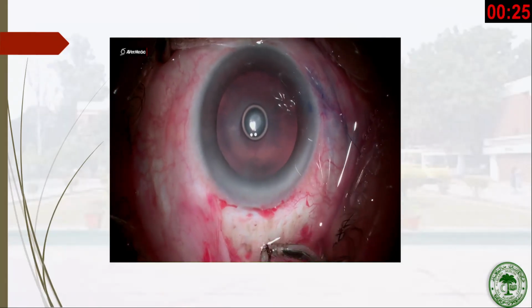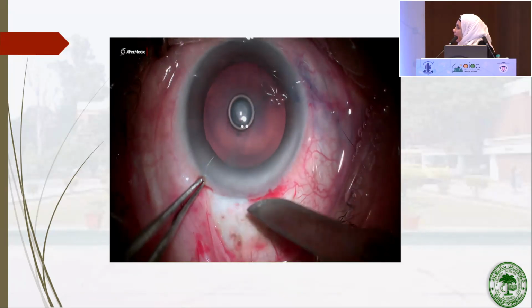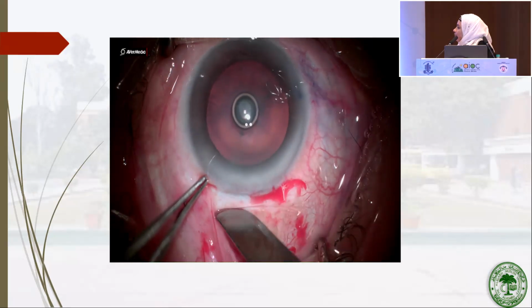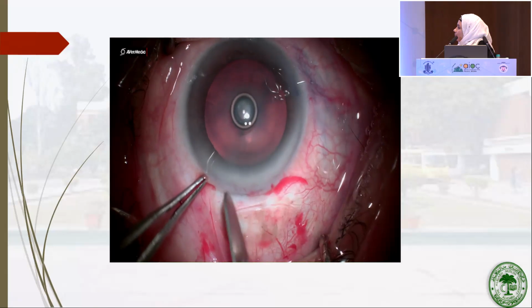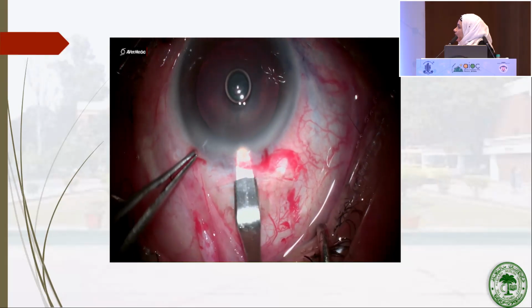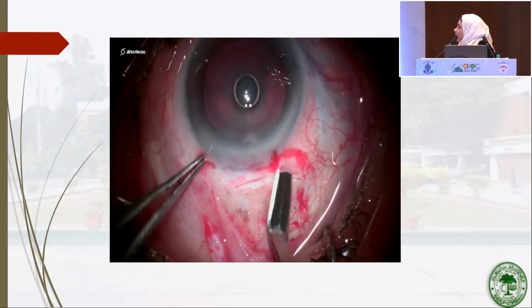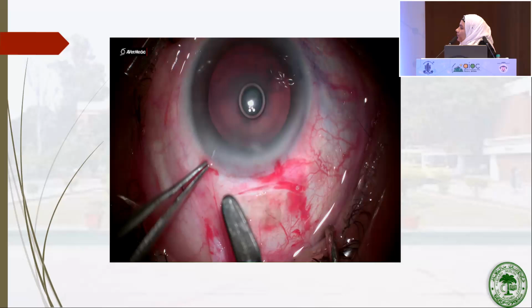I have another video where the lamellar separation can be created in 3 quadrants, and then the sideways cutting can be done. Here the lamellar separation is created in the center, and then in the two pockets in the lateral extremes, and then these three are joined, and care should be taken that the plane should be similar.